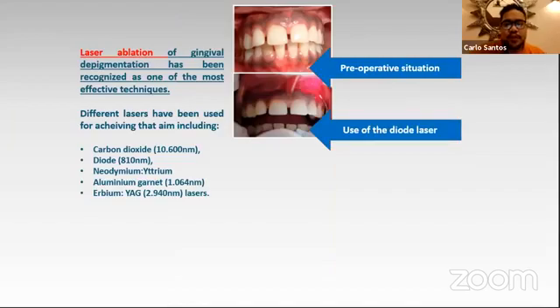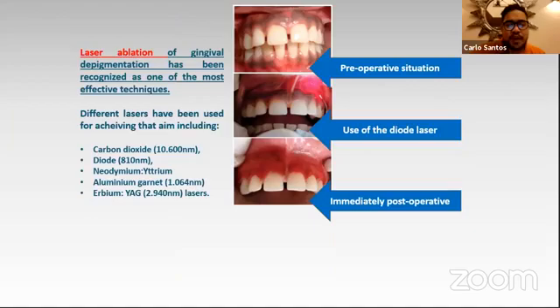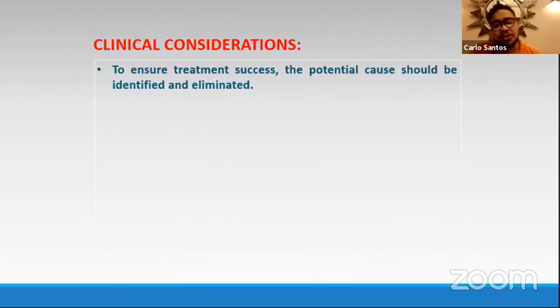So, use of the diode laser. Post-operative and one week post-operative, it looks normal and the patient is happy. Okay. Clinical considerations.